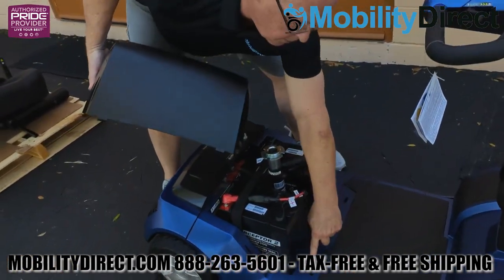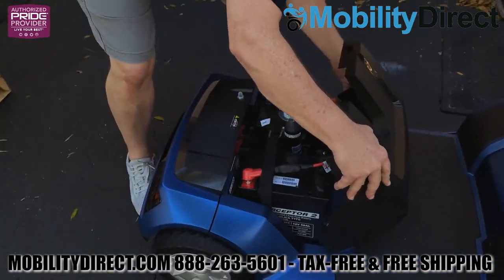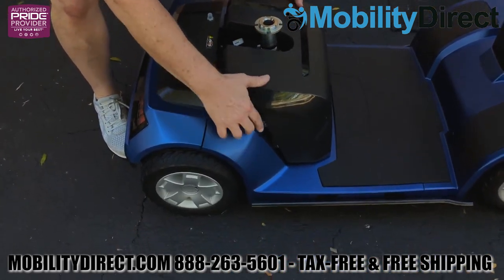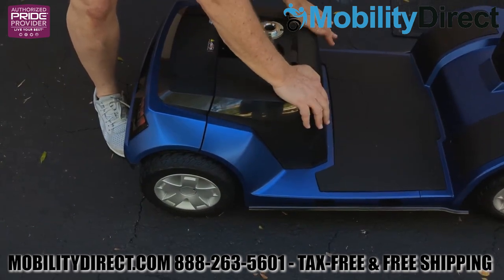Then just reattach the battery shroud cover. You'll notice there are two tabs on the front of the cover and two holes on the floorboard. We recommend putting those tabs in the holes first and then tilting the shroud cover back to connect it nice and easily. It might take a few times — don't get too frustrated. After doing it a few times, it should be a breeze.